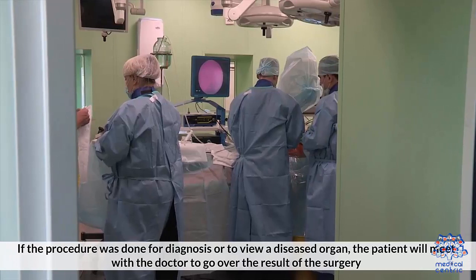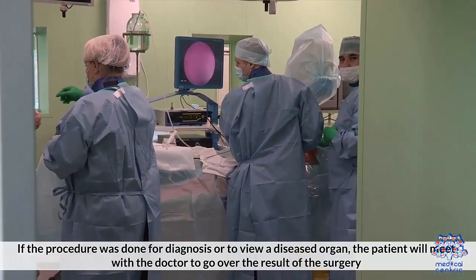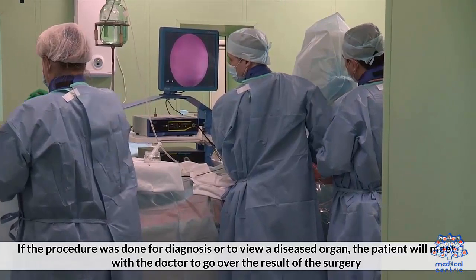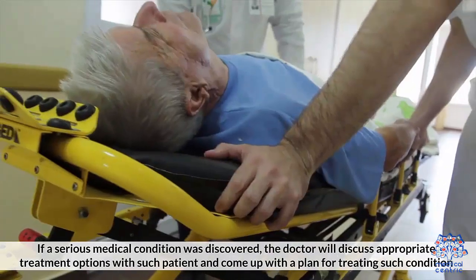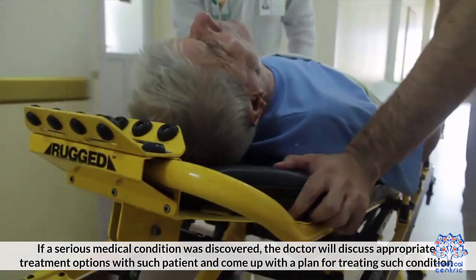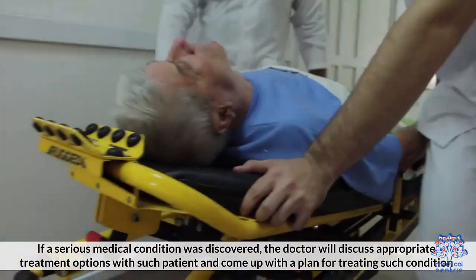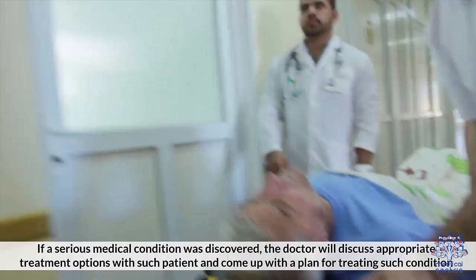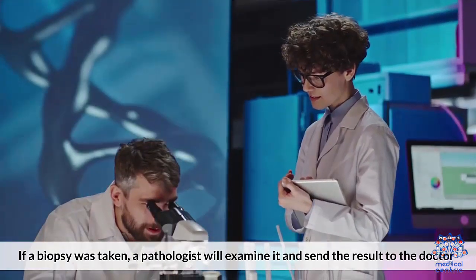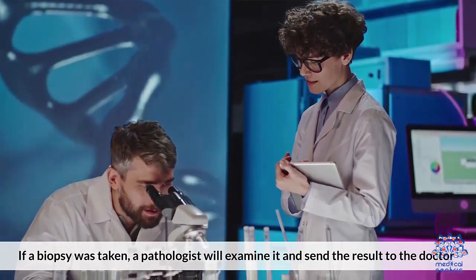If the procedure was done for diagnosis or to view a diseased organ, the patient will meet with the doctor to go over the results of the surgery. If a serious medical condition was discovered, the doctor will discuss appropriate treatment options and come up with a plan for treating the condition. If a biopsy was taken, a pathologist will examine it and send the result to the doctor.